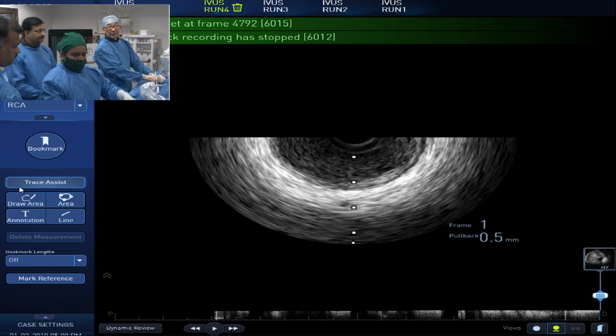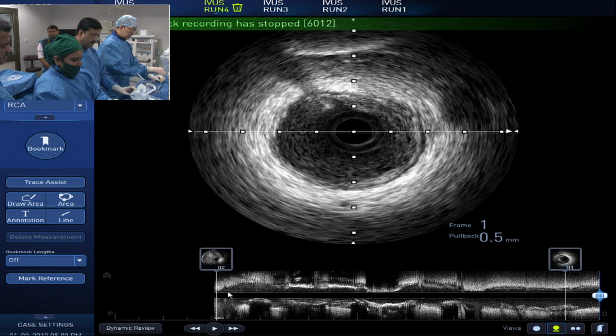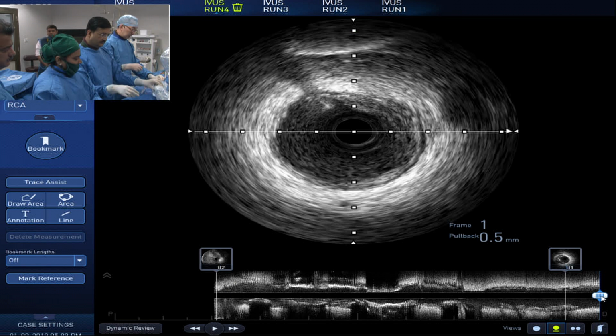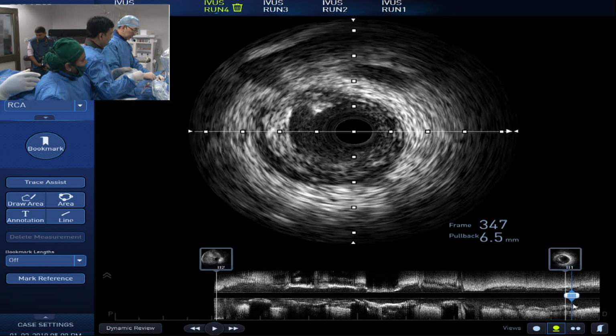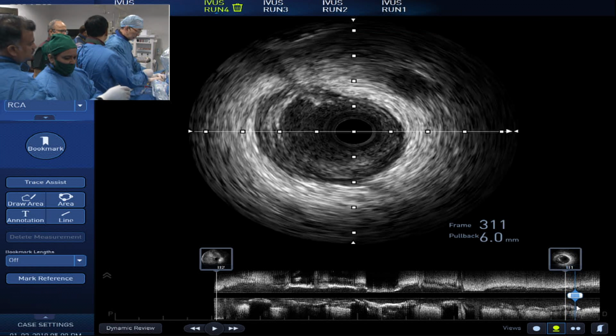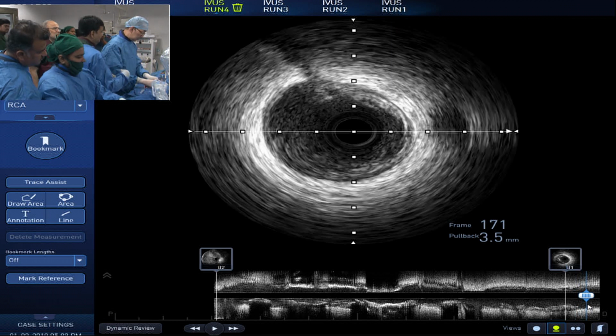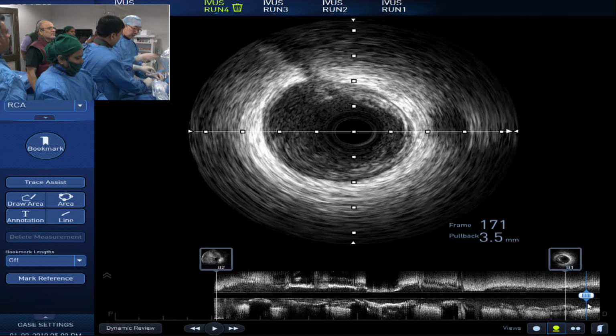In the UK, we use a lot of lithotripsy. This would be absolutely perfect for that segment. We've had great success with lithotripsy balloons in this sort of very focal 360-degree concentric calcification where rotablation won't touch the edges. I think lithotripsy would be perfect.